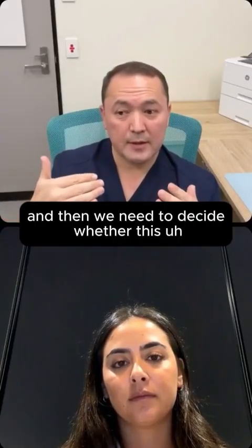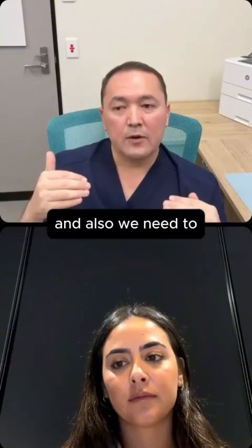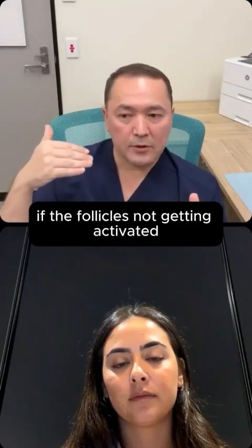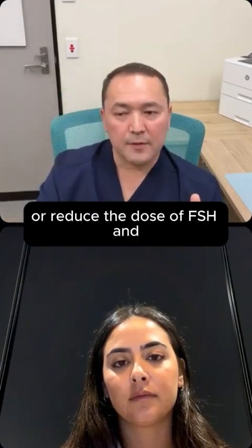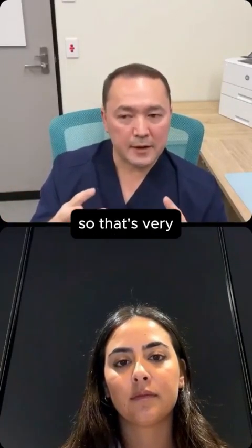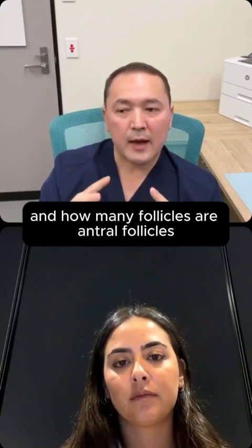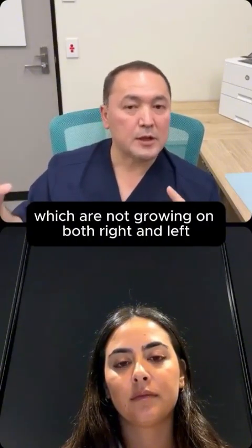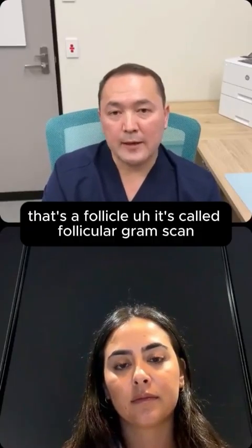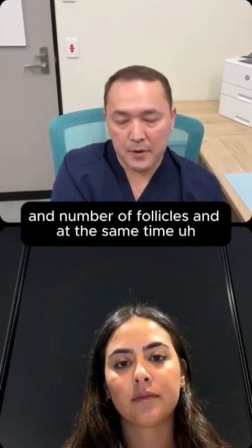And then we need to decide whether these follicles are big enough for triggering or not. And also we need to decide whether we should increase the dose of FSH if the follicles are not getting activated, or reduce the dose of FSH, or stop the FSH altogether before we trigger. So it's very, very critical for us to know the exact size of follicles and how many follicles are growing and how many are antral follicles which are not growing, on both right and left. That's called a folliculogram scan, which means we are scanning to check follicle sizes and number of follicles.